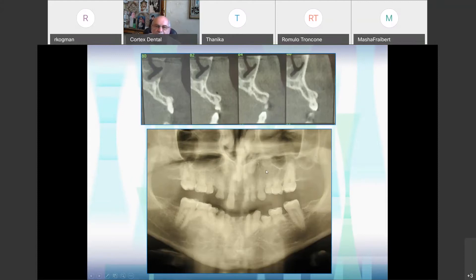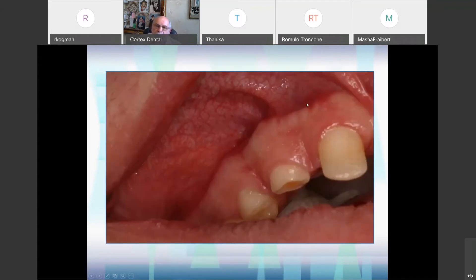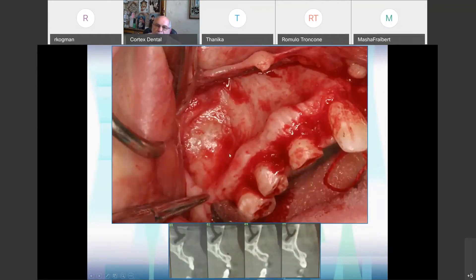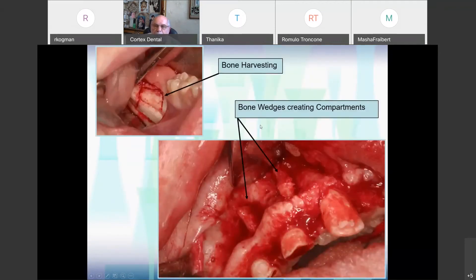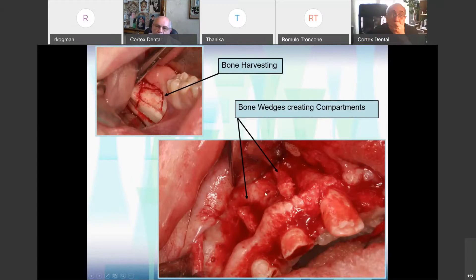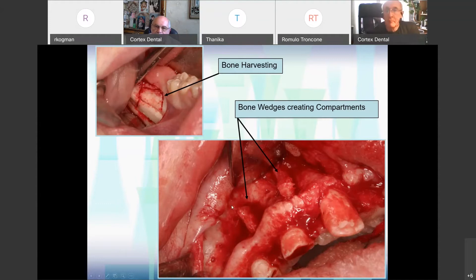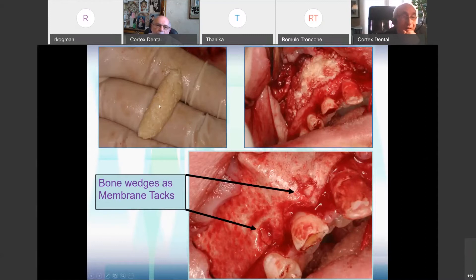He had only five permanent teeth: number 11 and all four first molars. You can see what happened — during growth the crest got a shape of a J. Here is the undercut. We raised the flap — here is the undercut. So what I did, I harvested bone from the retromolar area, made two slots or grooves in between, which went into the bone, creating compartments. I filled the depression with particulate bone.